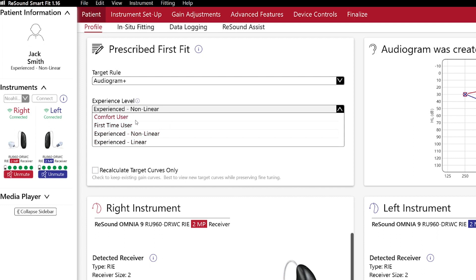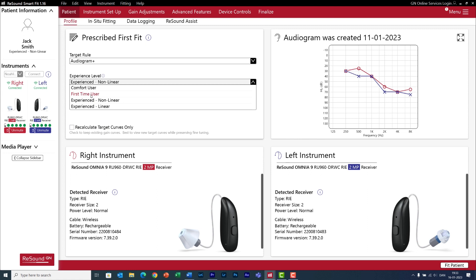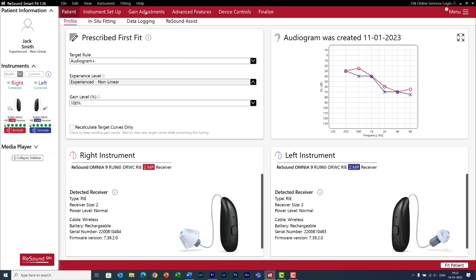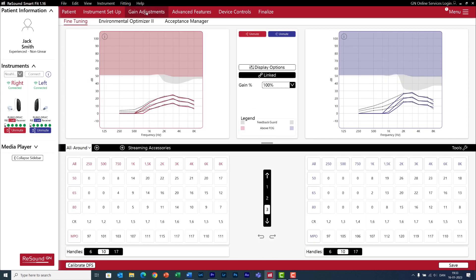You can also select how much experience your client has with hearing aids. For someone who is new to hearing aids, I choose first time user which allows me to give them the gain they need to restore audibility. But people react different to hearing aids and if they prefer to listen to softer sounds, you can choose comfort user. Now, these settings affect not only the gain of the hearing aid but also how the advanced features will be programmed.